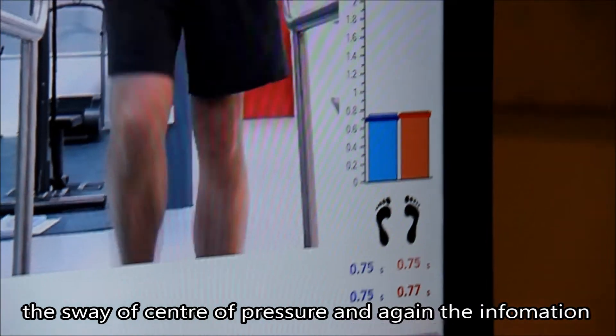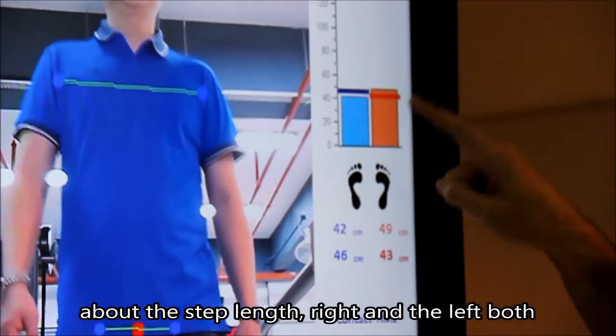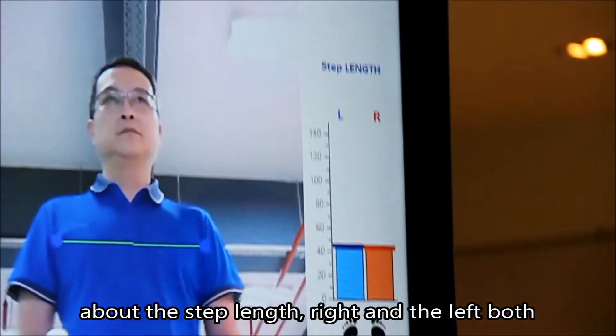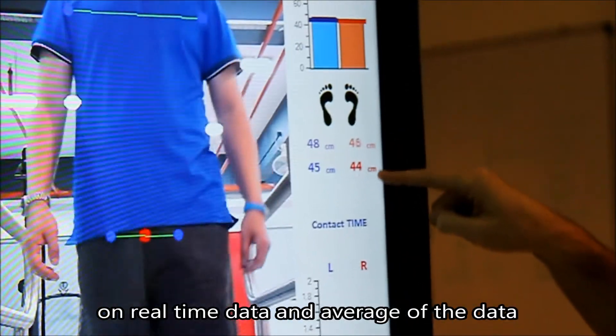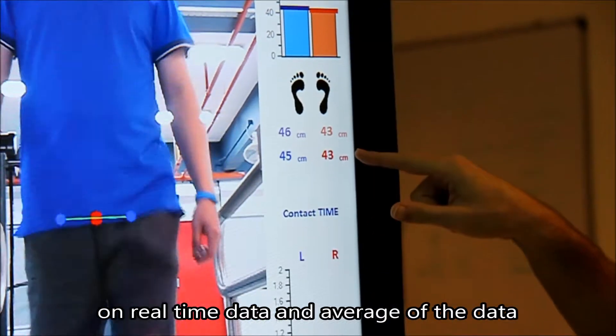And again, more information about the step length, right compared to the left, both in the real-time data and the average data.